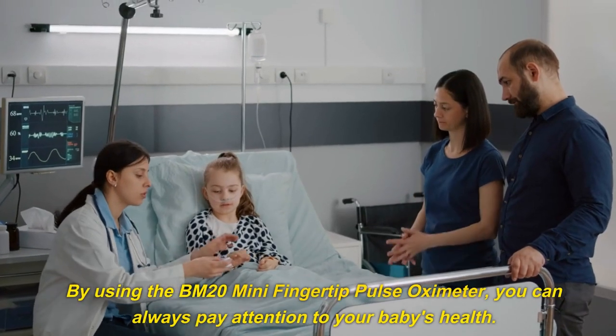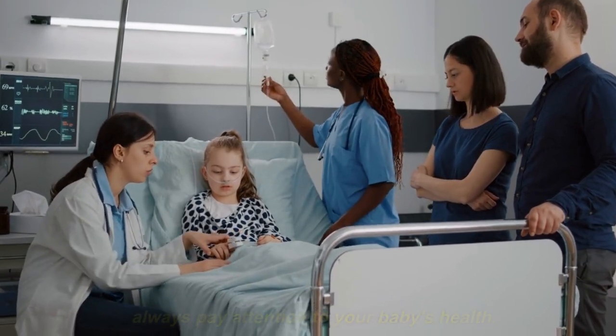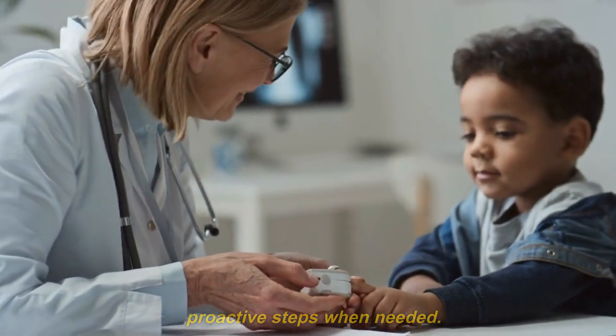By using the BM20 Mini Fingertip Pulse Oximeter, you can always pay attention to your baby's health. It empowers you to monitor your child's vital signs and take proactive steps when needed.